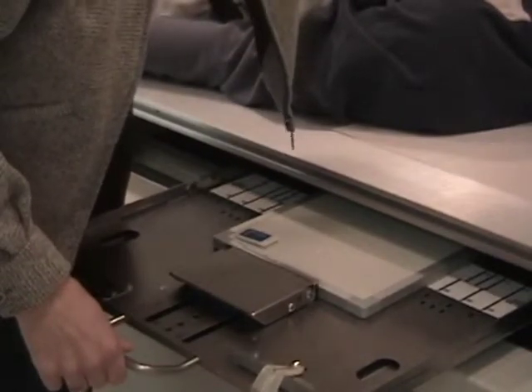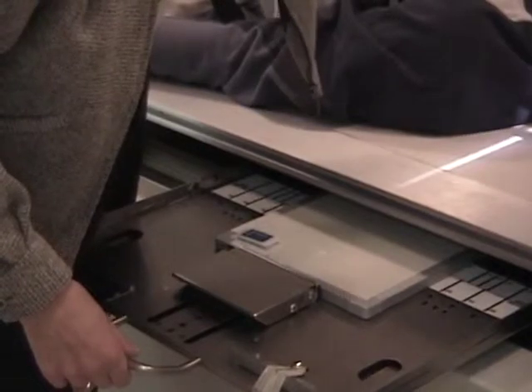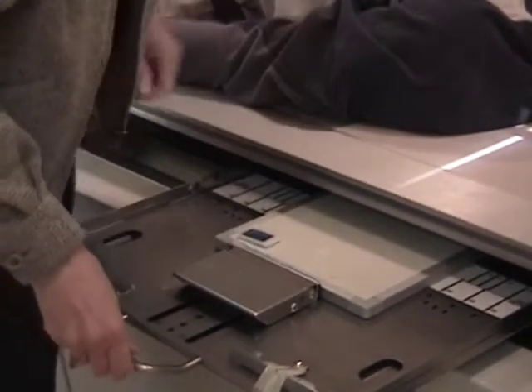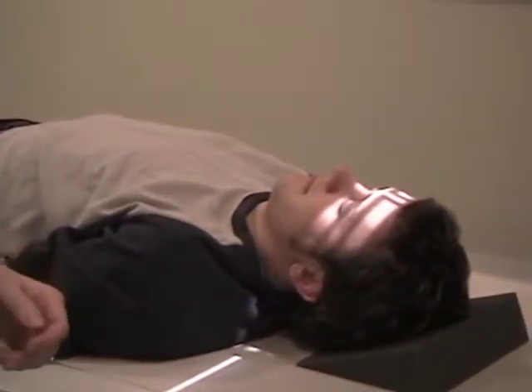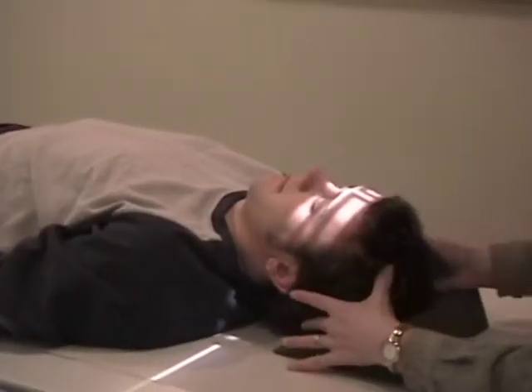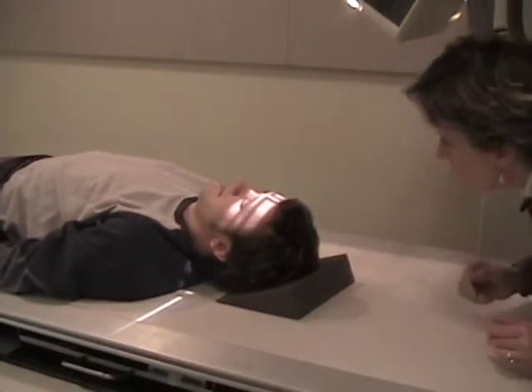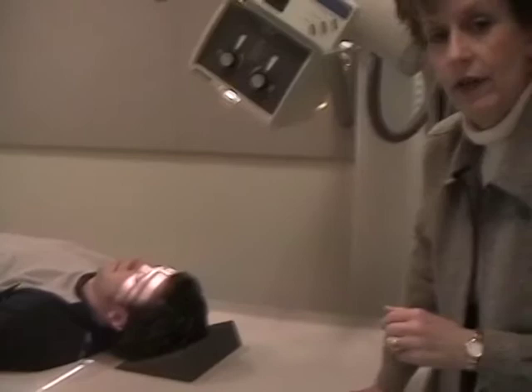I'm going to collimate this way. This way I need to have the 10 inches. Okay? But this way I can collimate tight for the TMJ. And then I need to check the MSP, making sure it's centered and perpendicular. And this is the AP axial with the zygoma, the point of interest.